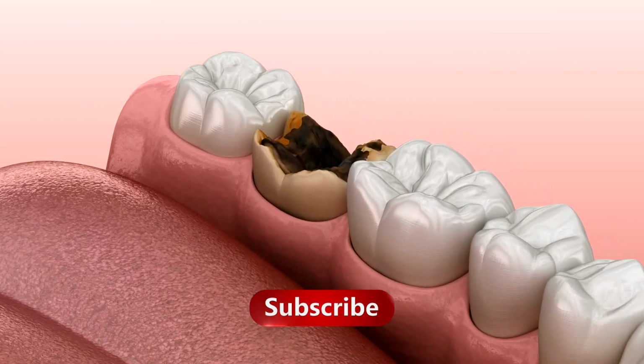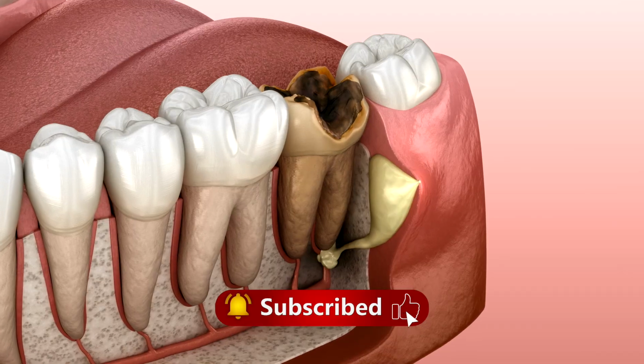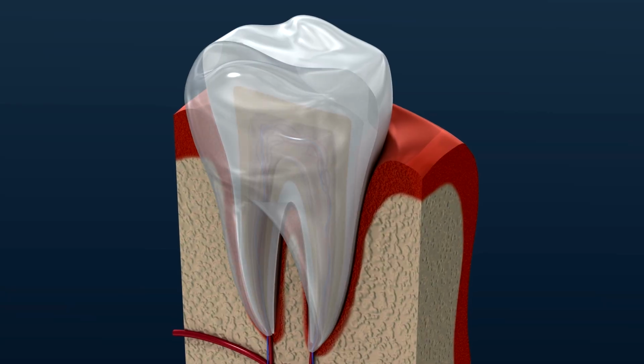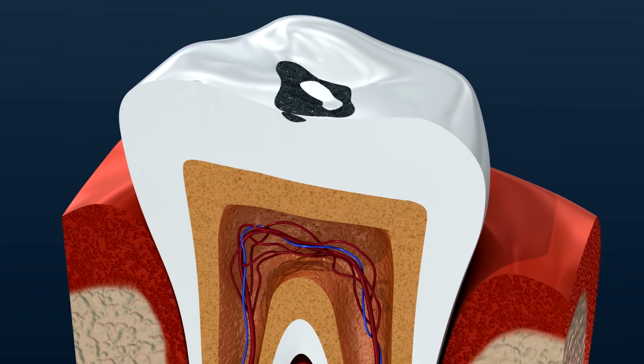Cavity teeth treatment. 3D animation. Cavity teeth are a common oral health issue worldwide. Treatment begins with a careful examination to determine the extent of decay.